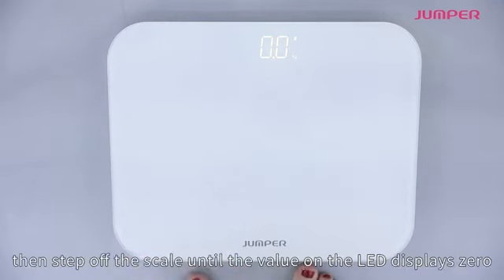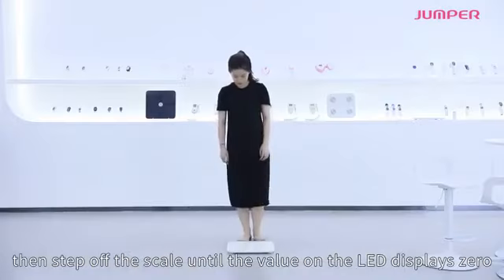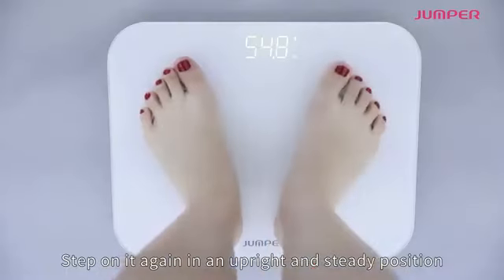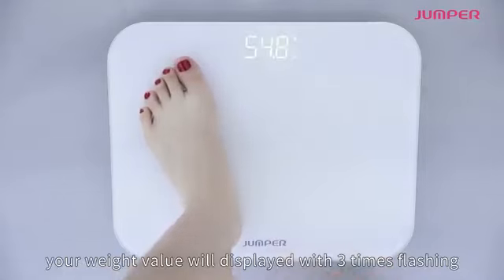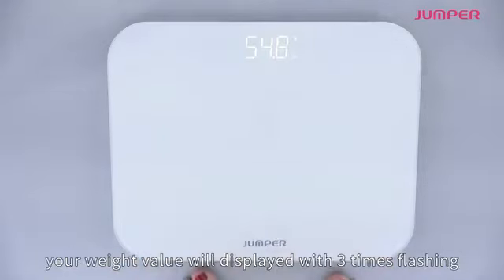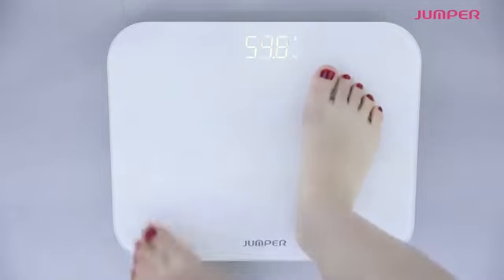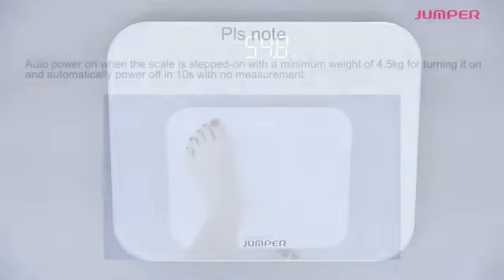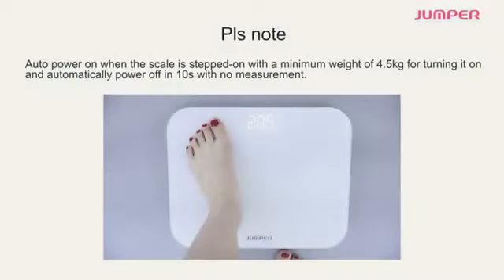Step off the scale until the value on the LED display reads zero. Step on it again in an upright and steady position — your weight value will display with three times flashing.